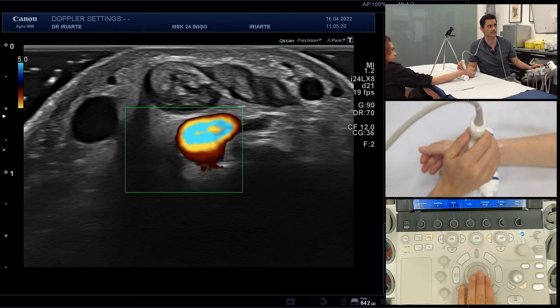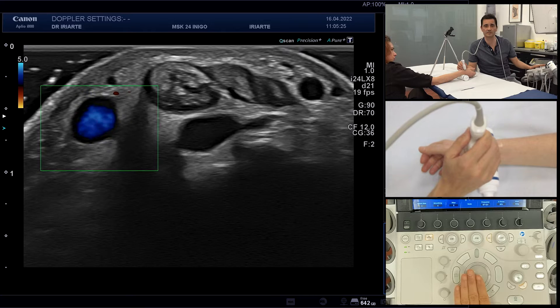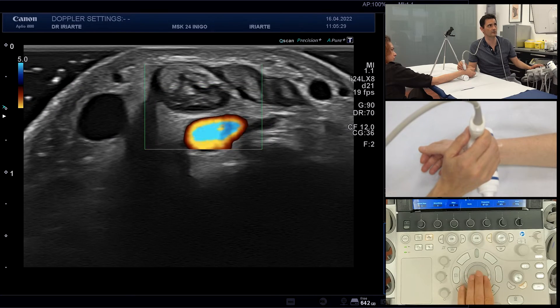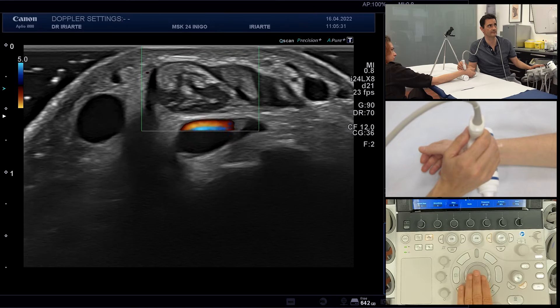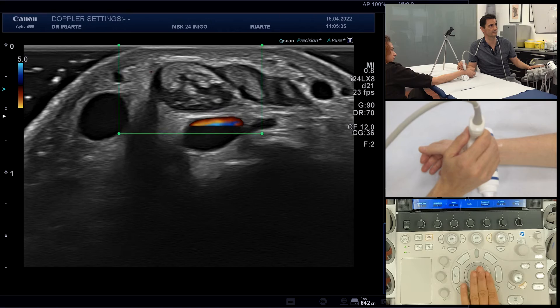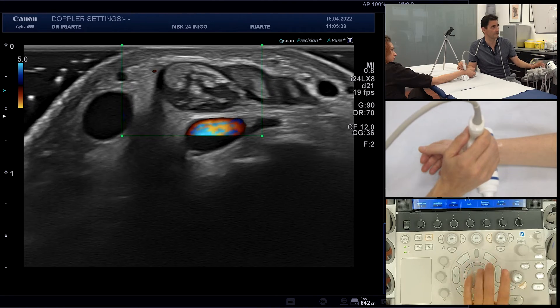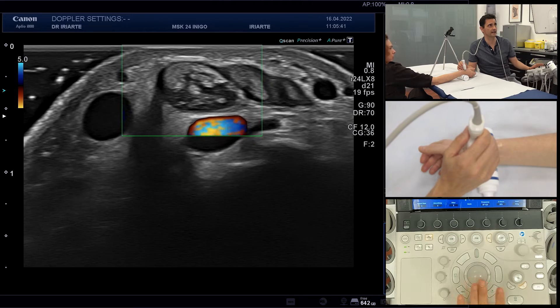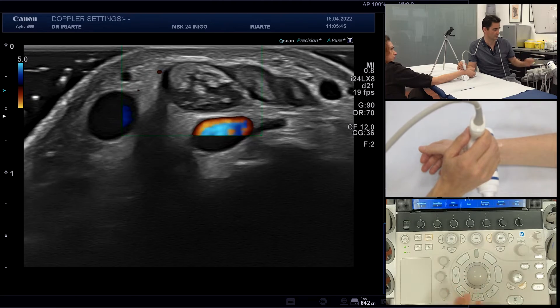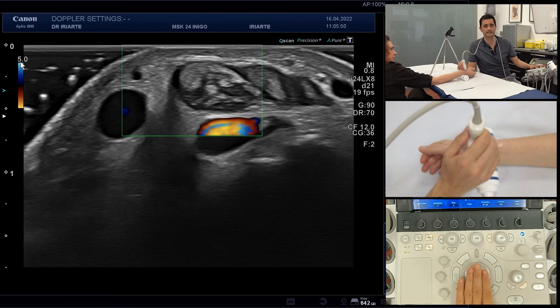If you notice, when the box is over this artery you can see the flow inside, but as we move the box we don't see the flow inside the artery. So we locate the box in the area we want to examine, adjust the size to have a good view — as small as possible — and once we have the size, there are other parameters we need to check.